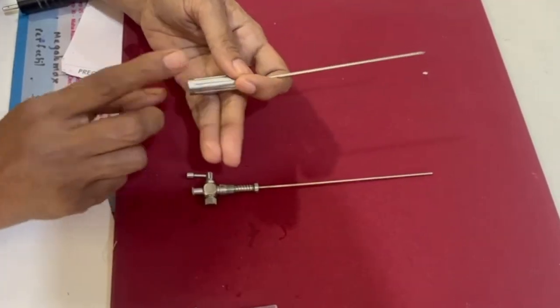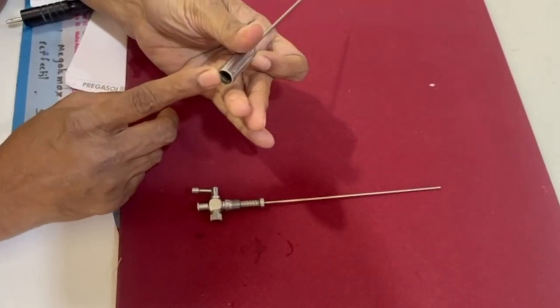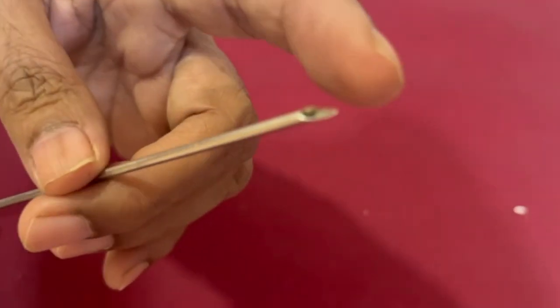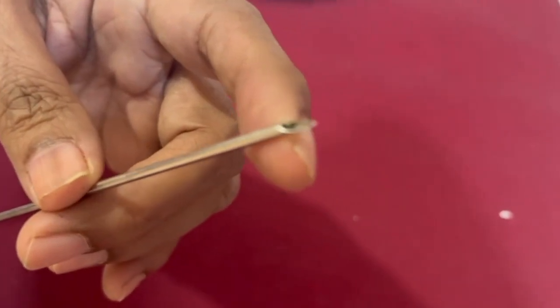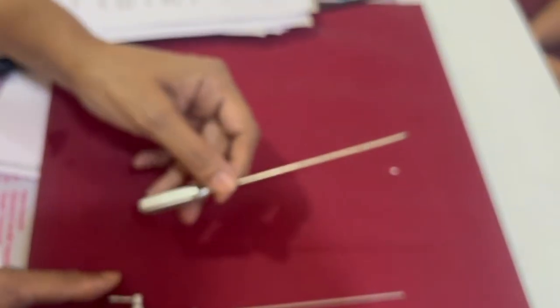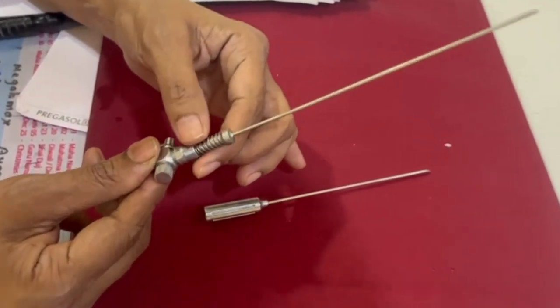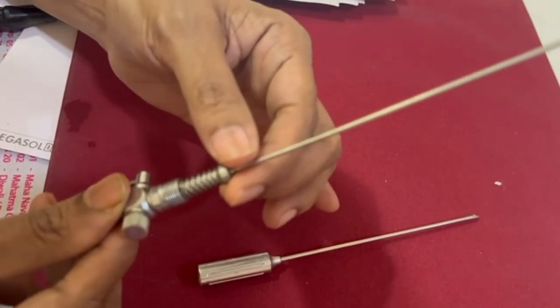The outer one is hollow and the tip has a sharp beveled edge. You can see this sharp beveled edge. This is the outer hollow needle.